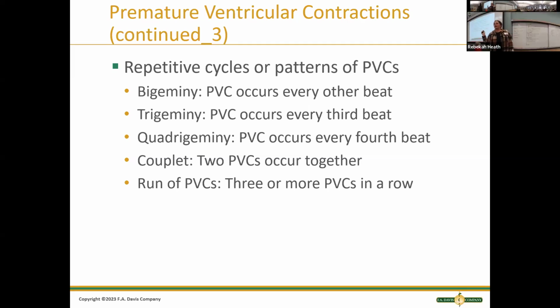Sometimes you'll have frequent PVCs. Bigeminy is where every other beat is a PVC. I had this happen to me once. No, I had trigeminy, where every third beat was a PVC.